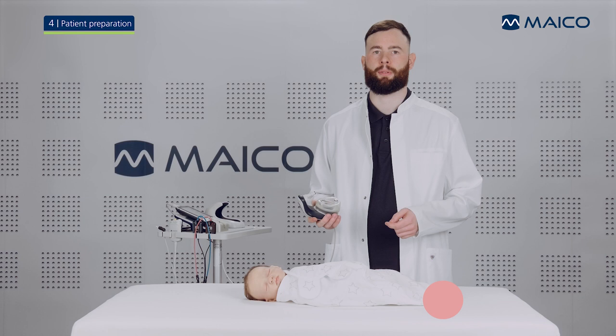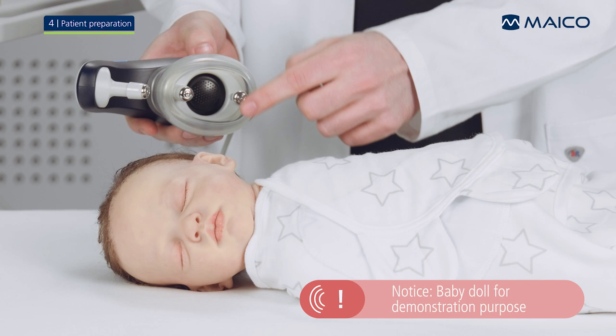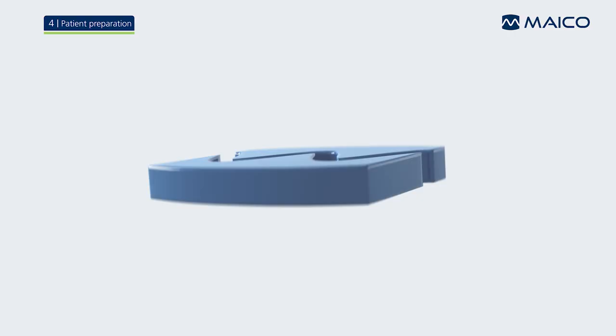The baby and the Baraphone need to be prepared before measurement. Locate the spots on the baby's head where the measurement electrodes of the Baraphone will be positioned. The mastoid electrode will be placed below the ear, the ground electrode right above the ear, and the vertex electrode approximately three fingers' distance on the forehead in front of the hairline.